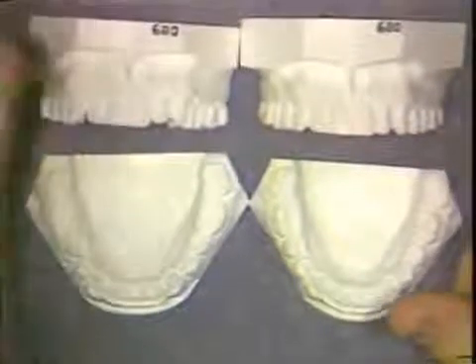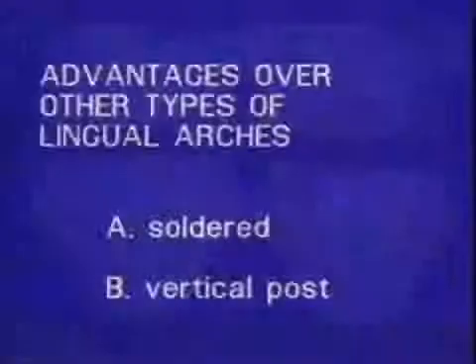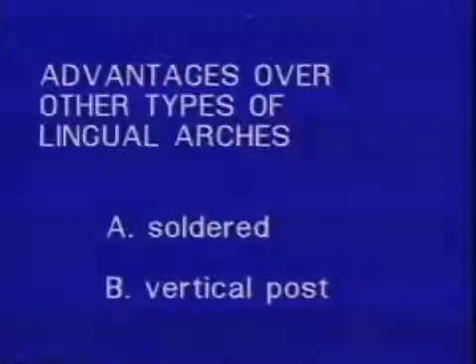I would like to discuss the advantages of the horizontal lingual arch in comparison to the other two lingual arches that are in conventional use.